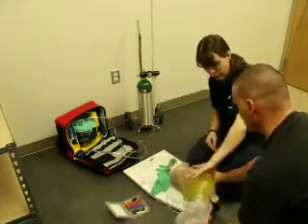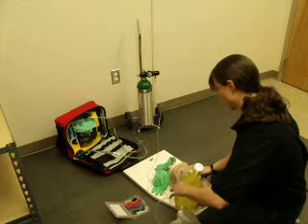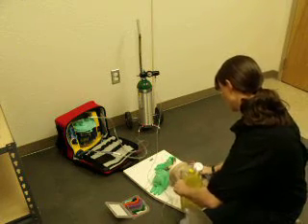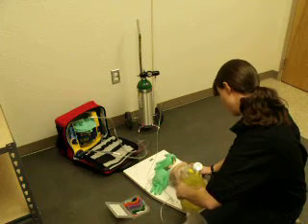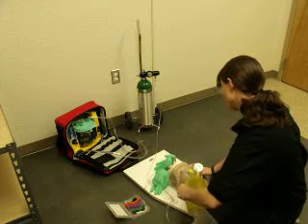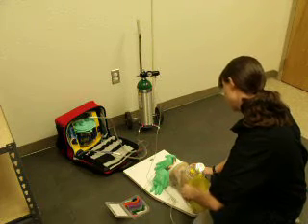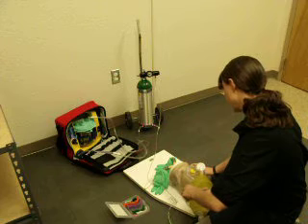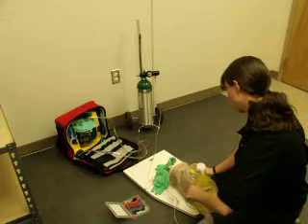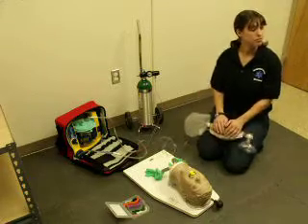And then I am going to take over ventilations again, providing one breath every five seconds, watching for adequate chest rise and fall. Still have good bag compliance. It's been thirty seconds with oxygen. At this time I am finished with my advance — would you like to add a change or do anything different?